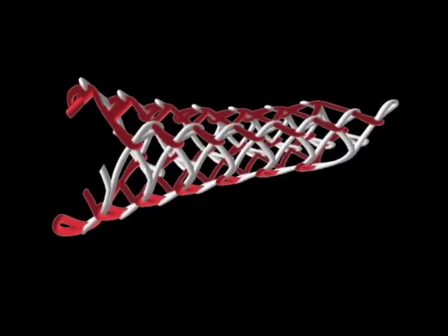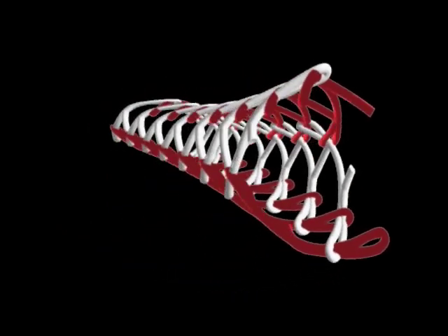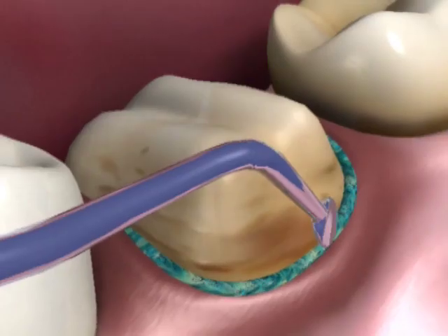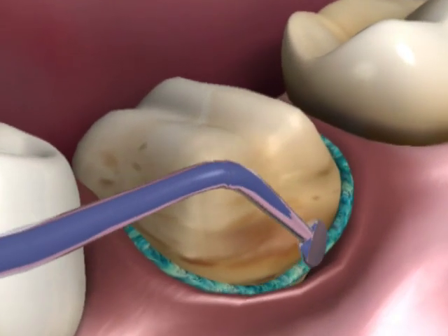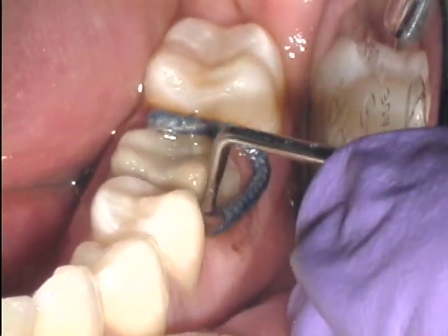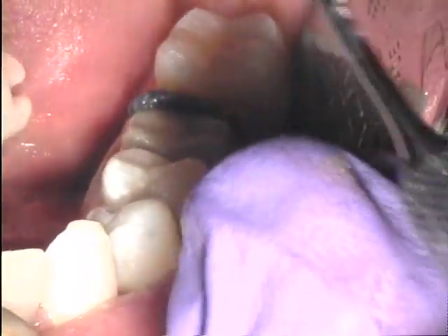Ultra-dense 100% cotton cords are knitted into long chains of microscopic interlocking loops. At first glance, these knitted cords may appear too large. However, the interthread space of the knit cord allows for easier compression and packing, and can carry a considerable quantity of hemostatic retraction solution in comparison with braided or twisted cords.